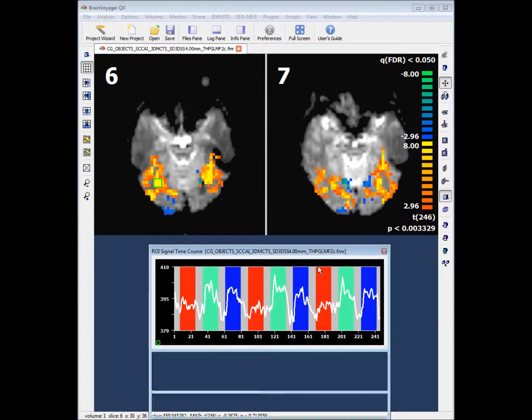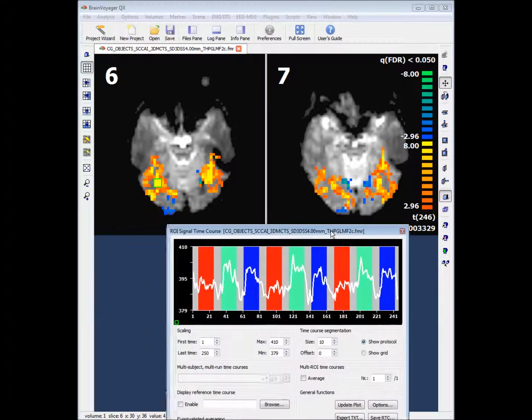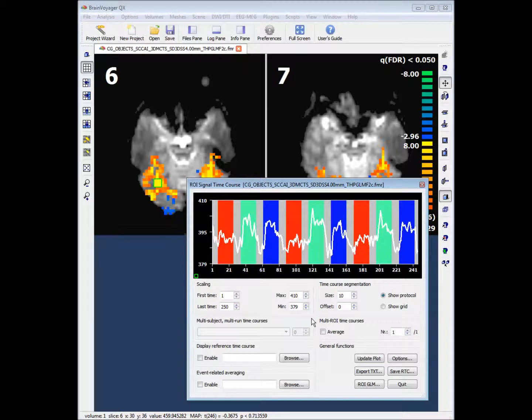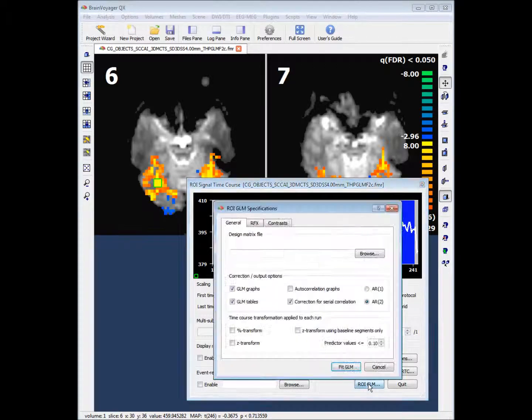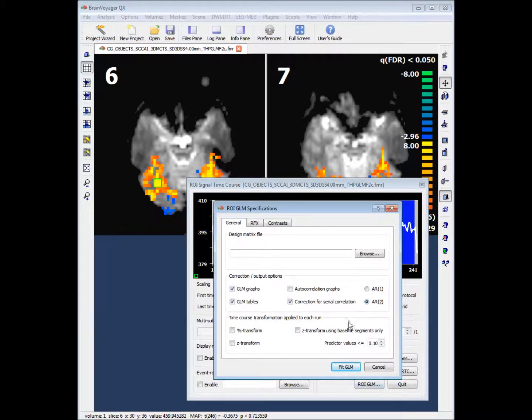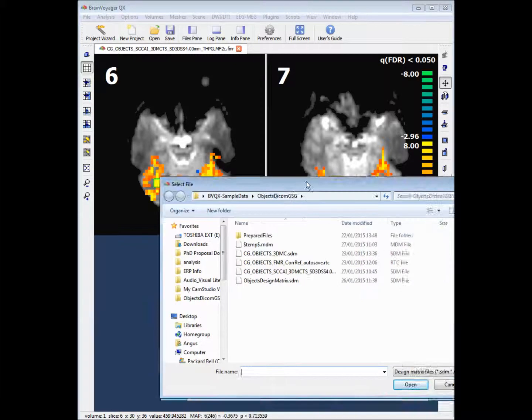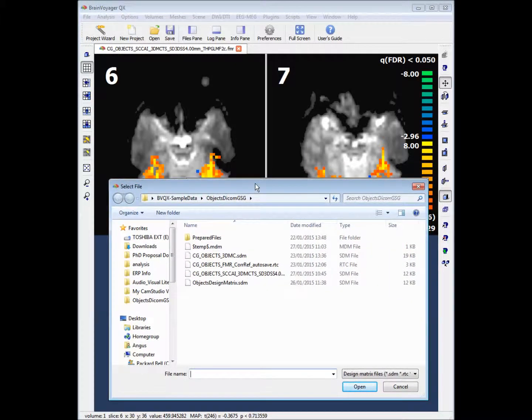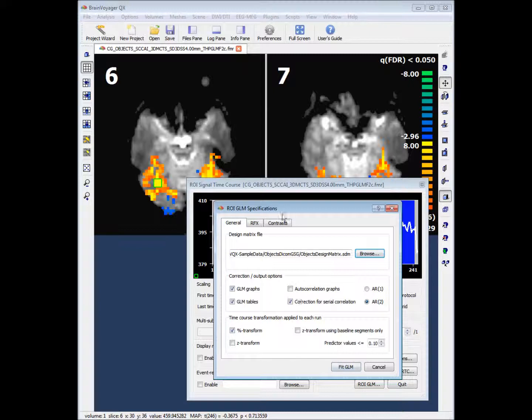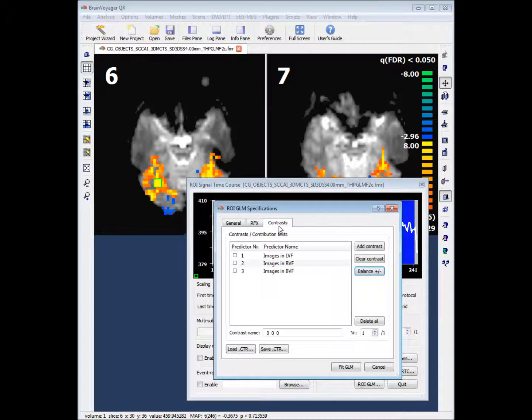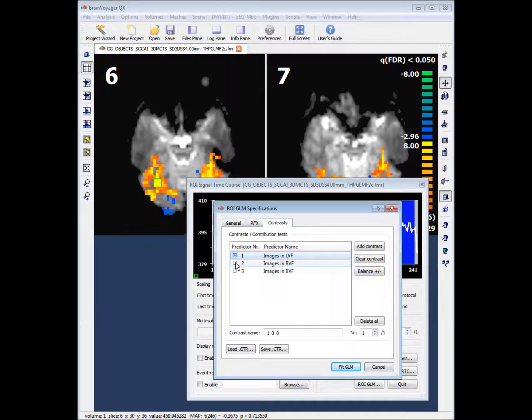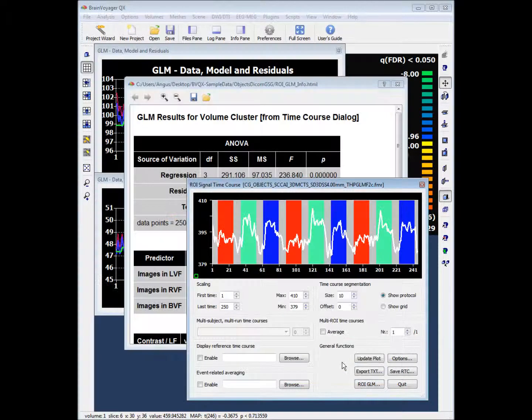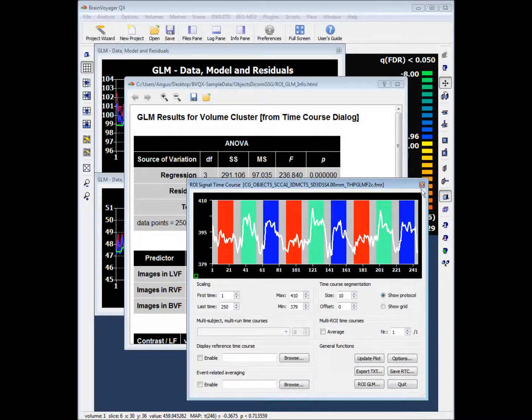If you click anywhere in the signal time course window you will get some expanded options. If you now click on the region of interest GLM button, we want to browse to the design matrix file that we created in a previous step. Once we have selected this file we want to define a contrast. If we put a cross in the first predictor and a minus sign in the second predictor, we can then fit the GLM.